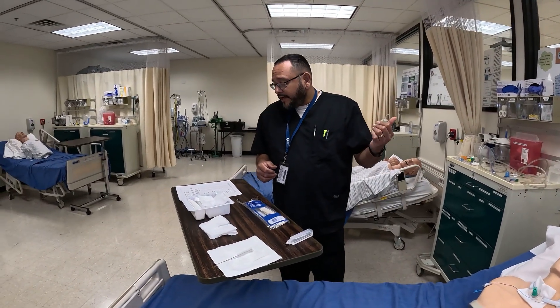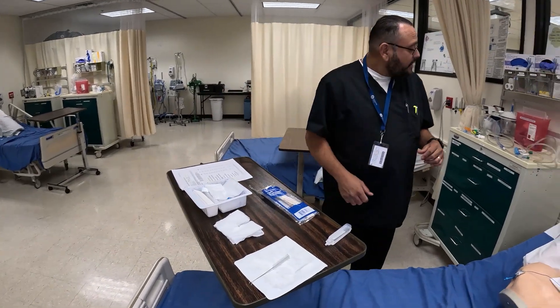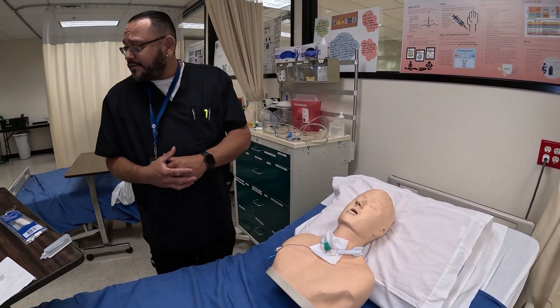After I get all my equipment together — I'll go over it with you shortly — I'm also going to take my stethoscope and listen to his lungs. If he needs any type of suctioning, I would go ahead and suction first.